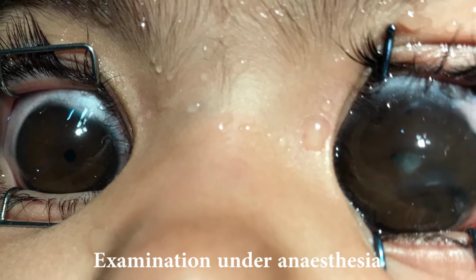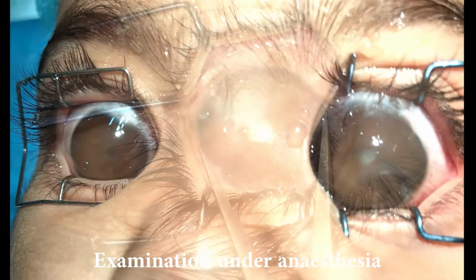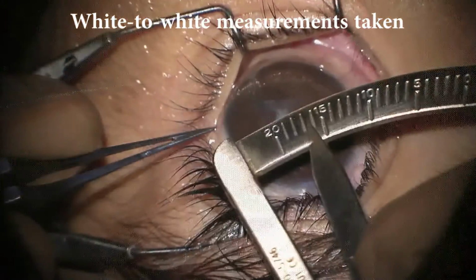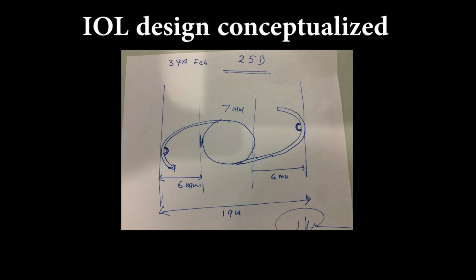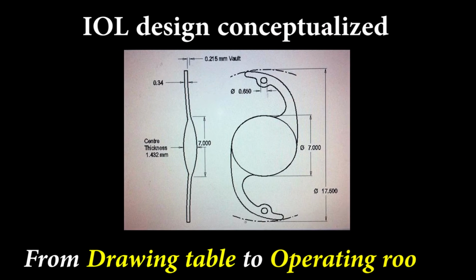An examination under anesthesia was undertaken for detailed evaluation of both eyes before planning the surgery. White-to-white measurements were taken to plan the appropriate size of the IOL. The intraocular lens design was conceptualized and brought to life from the drawing table to the operating room.